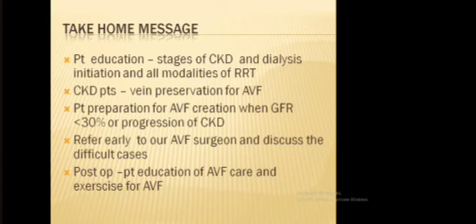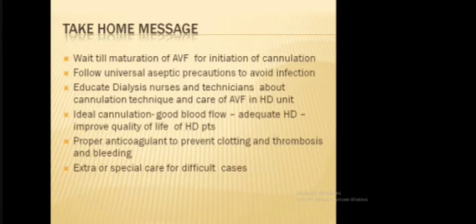Postoperatively, education of the patient on how to care for the AVF, and AVF exercise, is very important for early maturation of the AV fistula. Wait until maturation of the AVF before initiating cannulation. Early cannulation will lead to a lot of complications like hematoma, infiltration, and early failure of the fistula.